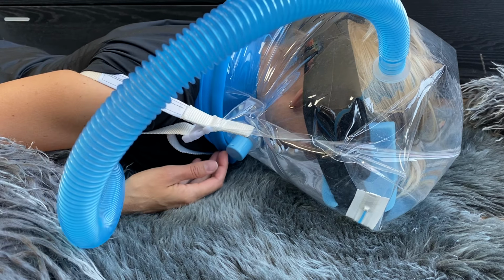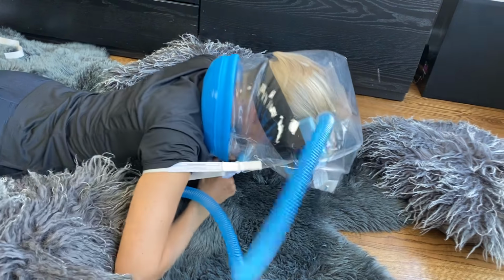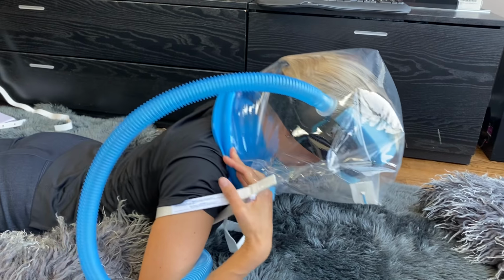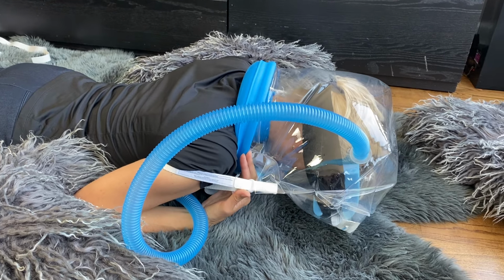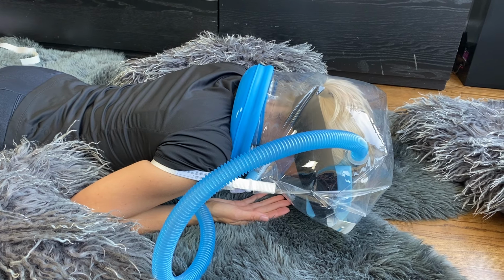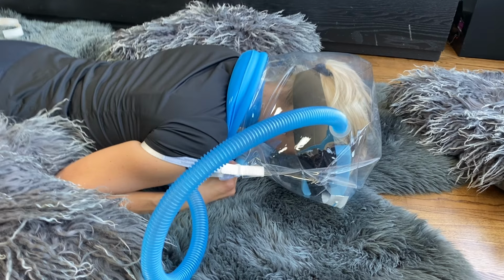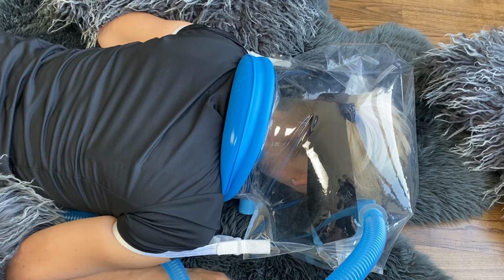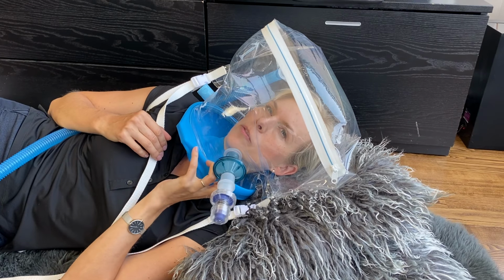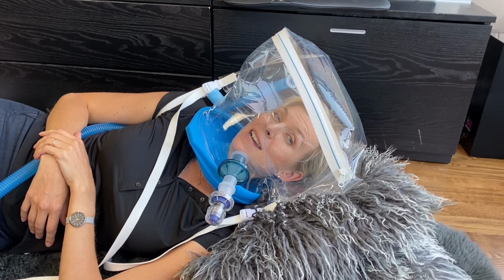And here we go. Also, you want to make sure you adjust so there is no air leak. This neck seal can be smaller for me. Like I said, I probably need a kid size.